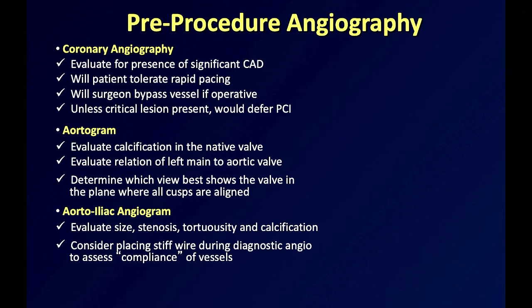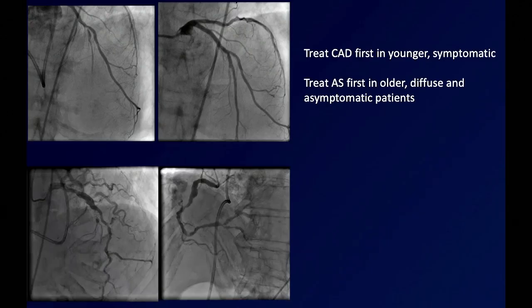So that actually tells us whether we can do it from the groin, femoral access, transfemoral, and if it's not possible, whether subclavian or carotid. Our alternate access, if it's not transfemoral, is actually right carotid. That's our preferred alternate access that we use.